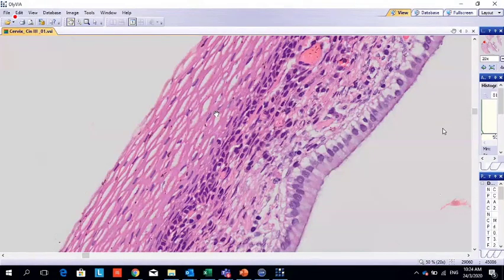Doctor, are they all squamous cells? Yes, all squamous, but this is a kind of maturation. The basal layer is like the niche. If there is any damage to those cells, from parabasal they can mature more to go up.